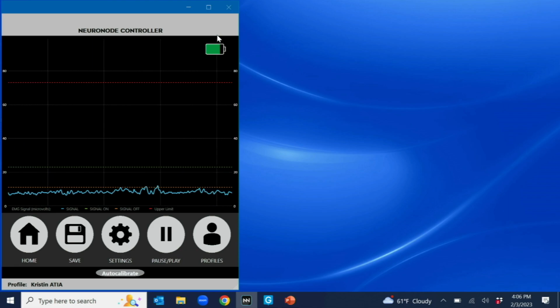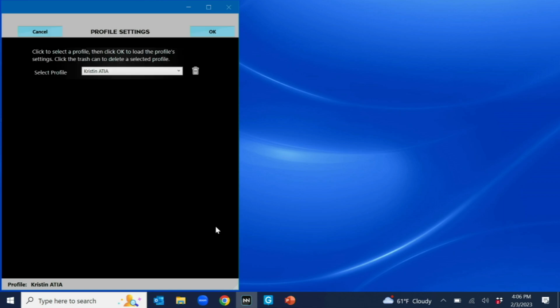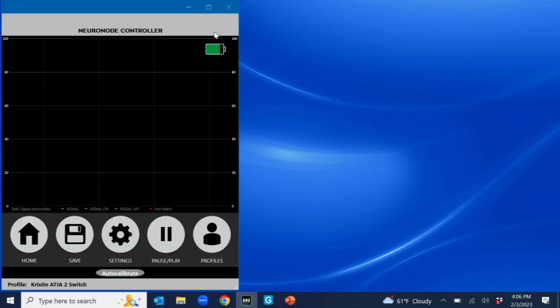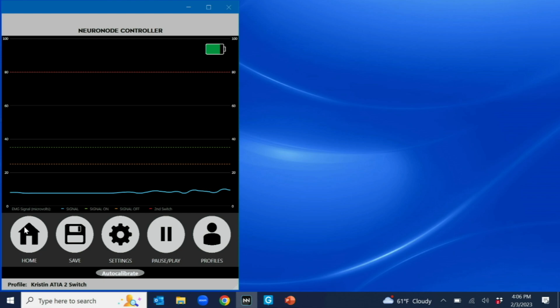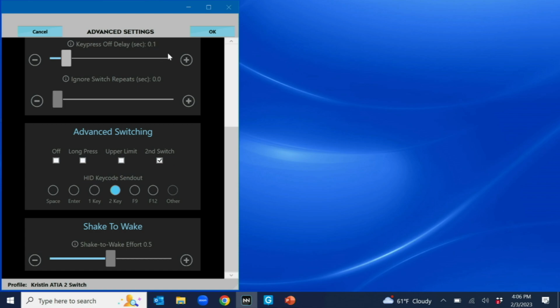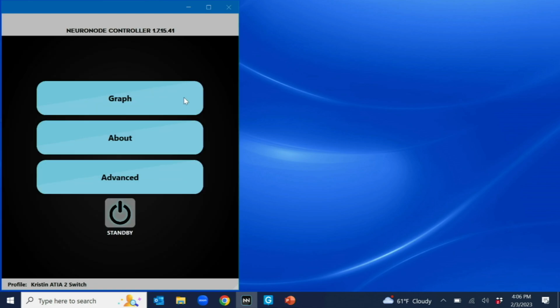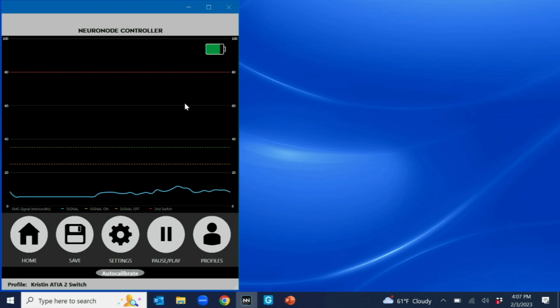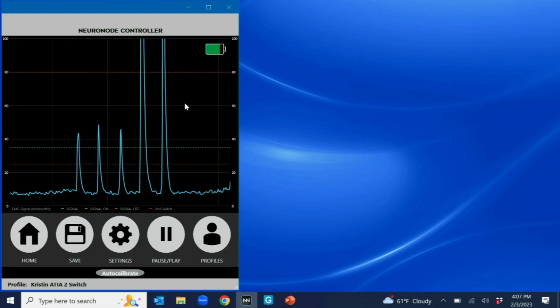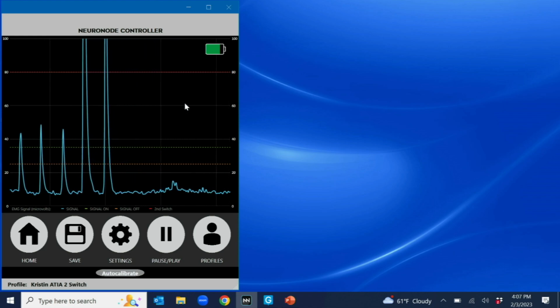Something that's related is what we call a second switch. So let me make a couple of changes here in my software. First, I'm going to go to my second switch profile, and then I'm just going to make sure that it's set the way I want it. Yep, so it's set for a second switch. So what this means is that if I have an individual, and this is definitely not all individuals, but if I have an individual who can make that small movement and can make a bigger movement purposefully, then I can set this up potentially for two-switch scanning.